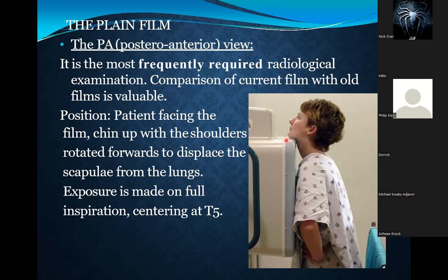So they put their chin here on top, they put their hands on their waist and try to move their elbows forward, and that sort of separates the scapulae away from the back and allows the ribs to go through. Okay. And also at this point, I'm sure you've all taken X-rays before. They'll ask you to take in a deep breath. Okay, so when you're at the height of the deep breath, then the X-ray will be taken. Okay, and we'll understand that shortly.